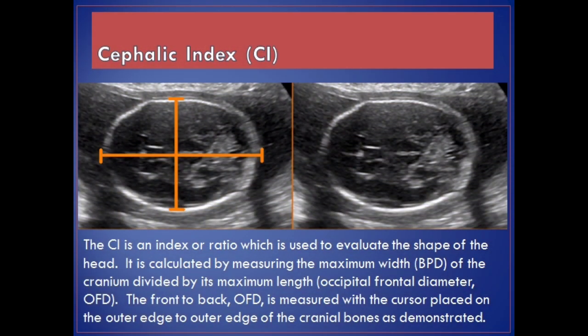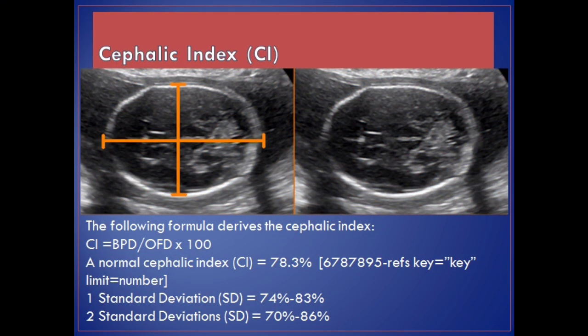Cephalic index, CI. The CI is an index or ratio used to evaluate the shape of the head. It is calculated by measuring the maximum width, BPD, of the cranium divided by its maximum length, occipital frontal diameter, OFD. The front-to-back OFD is measured with a cursor placed outer edge to outer edge of the cranial bones as demonstrated. The formula is: CI = BPD / OFD × 100. Normal cephalic index: CI = 78.3%; 1 SD = 74%–83%; 2 SD = 70%–86%.